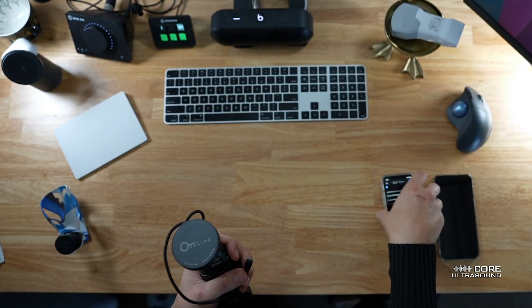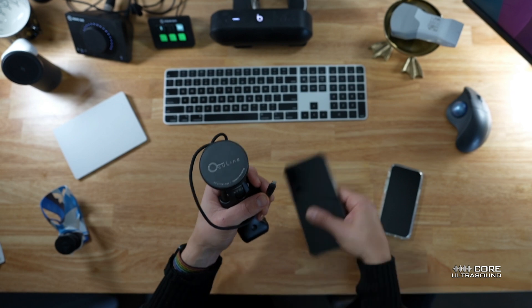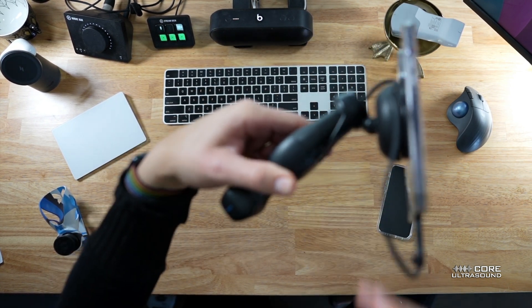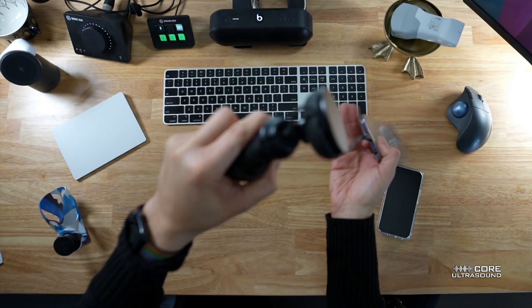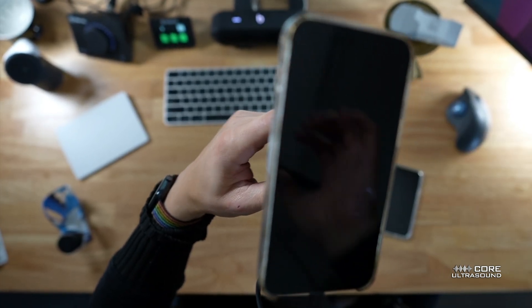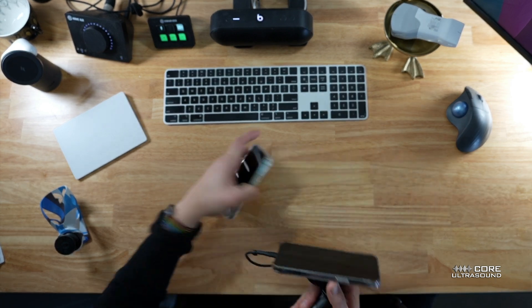The 12 Mini, I think, works the best for this. But if you want to use the Pro Max — it's either like smaller or giant — you can see here that it is a bit more unwieldy. Moving it around, if I fling it around too much, it will actually fall off, which none of us actually want. So while the big phones definitely work, what I would actually suggest is using the mini.